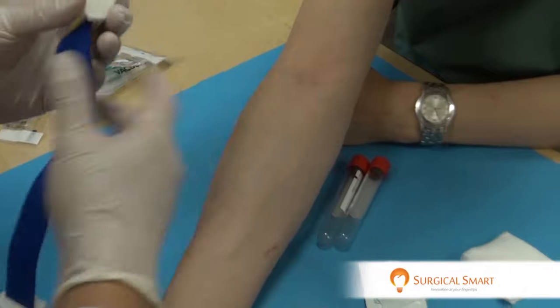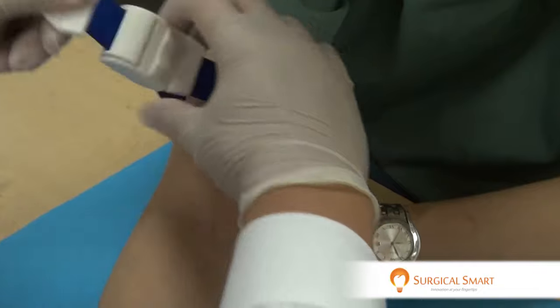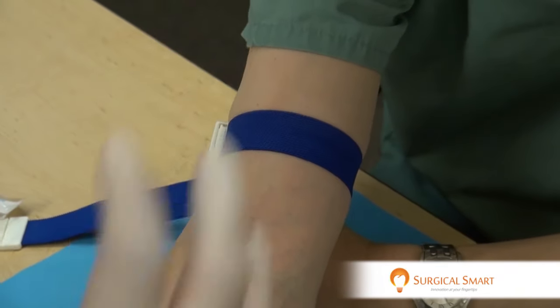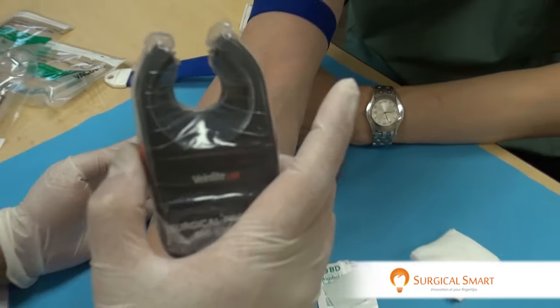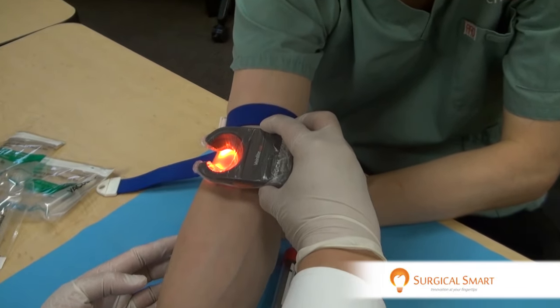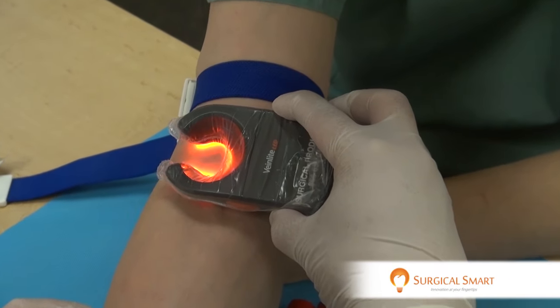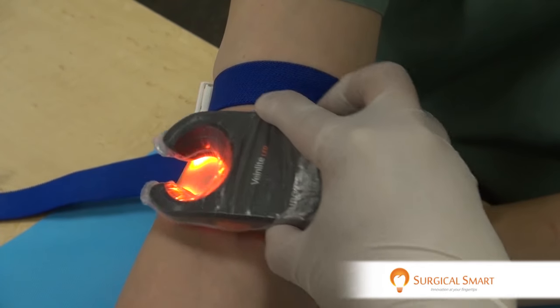You can secure the arm with your tourniquet per normal and then fasten it. Now, you have the patient pump their fist so that the veins engorge. You turn on the VeinLight and just take it and drag it laterally to medially, observing the center part of the VeinLight — and you can actually see where the vein shows up.